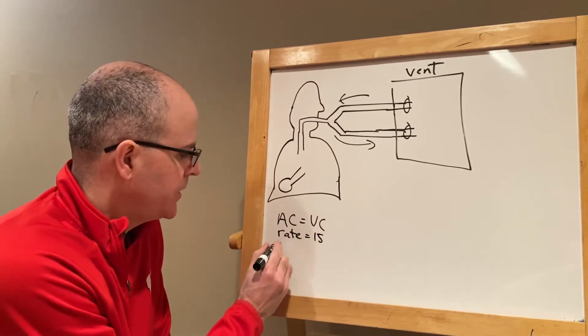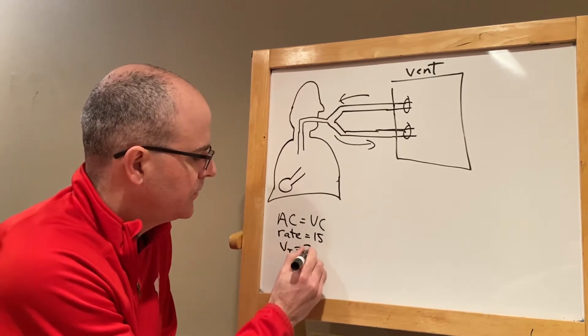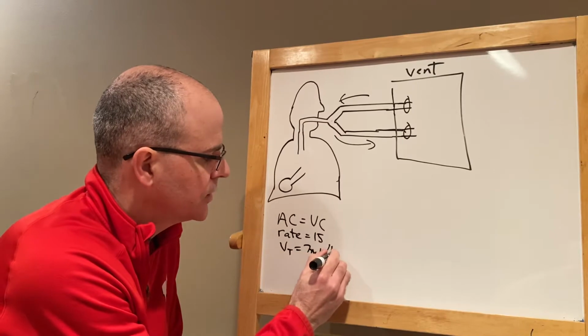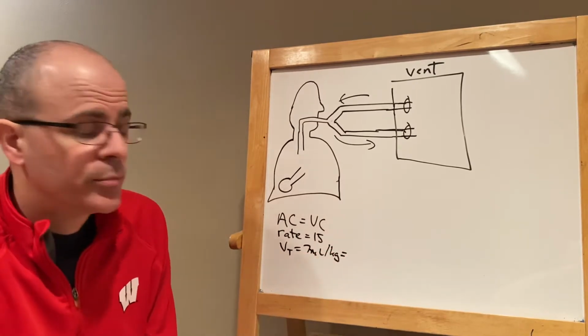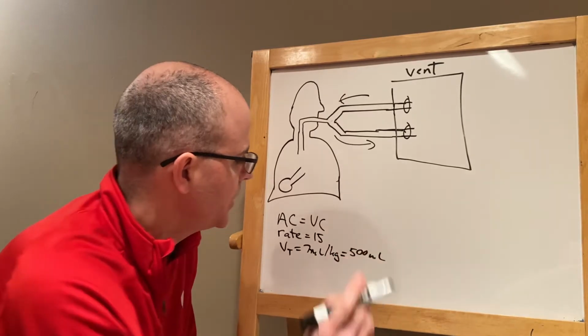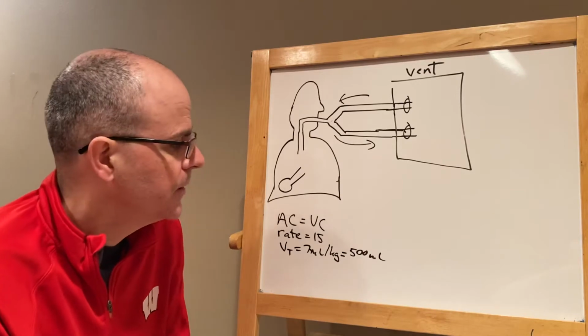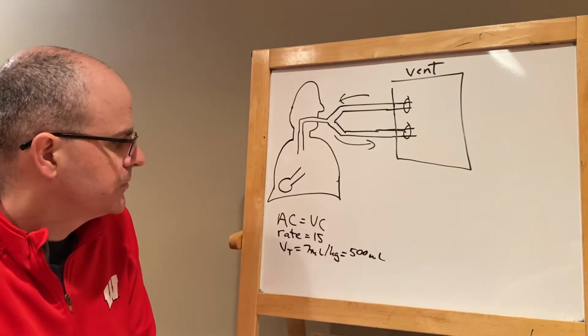You'll set a tidal volume, which we describe as V subscript T. Typical tidal volume might be something like 7 mLs per kilogram. If you have a 70 kilogram person, that would be something like 500 mLs. Since May of 2000, it's been traditional to use 6 mLs per kilogram. That would certainly be a safe choice for most patients.